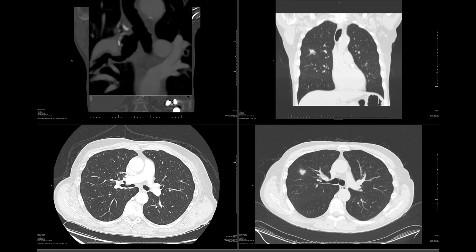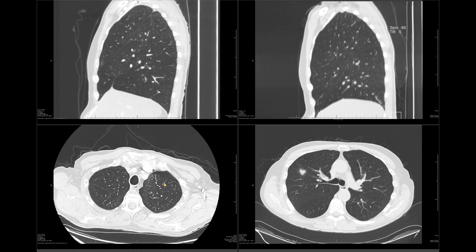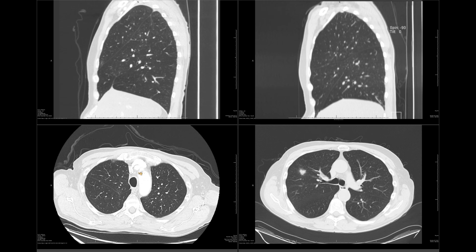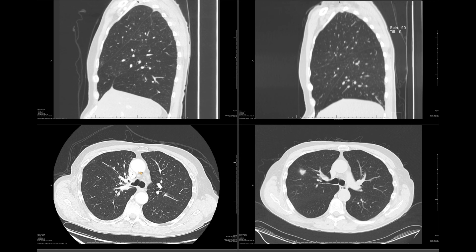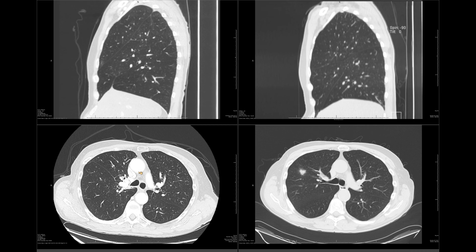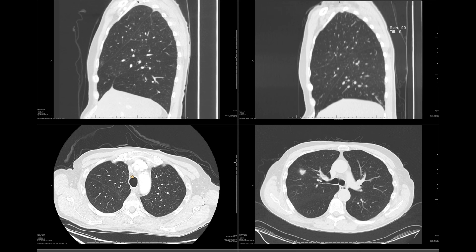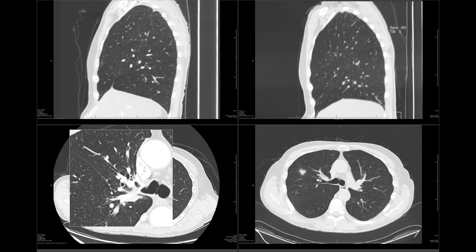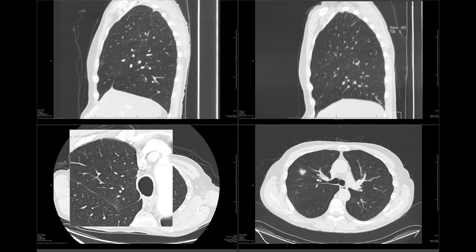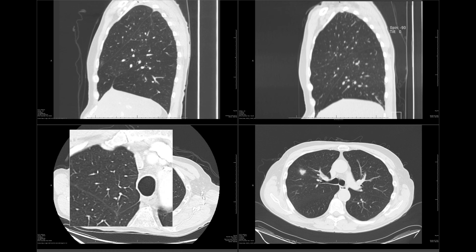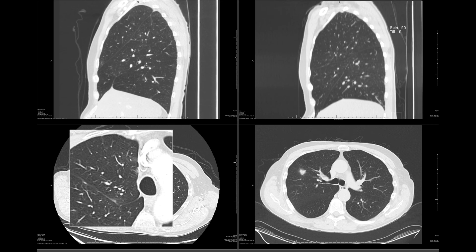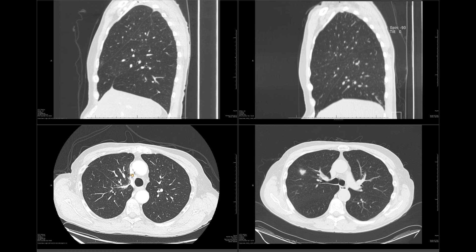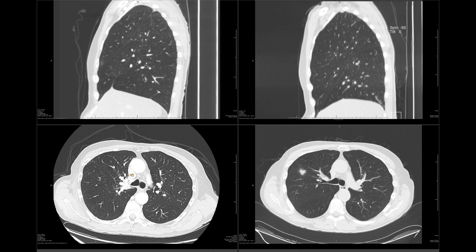I want to show you the lung parenchyma and the fissures. On the axials, you can see that the right middle lobe has expanded and migrated superiorly to take the place of where the anterior and apical segments of the right upper lobe used to be. There will typically be staple lines along the margins of the remaining lobes because frequently these fissures — in fact 80% of the time the minor fissure is not complete — so to properly divide one lobe from the adjacent lobe without an air leak, the margins have to be stapled shut.